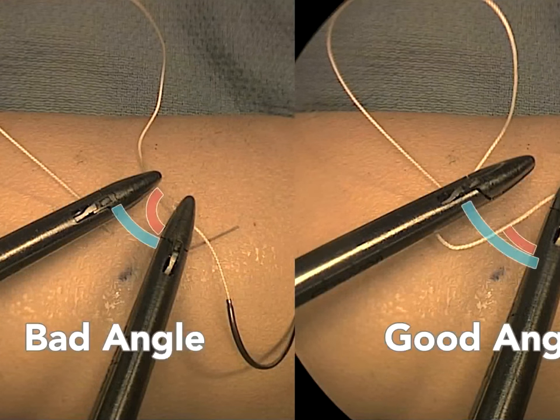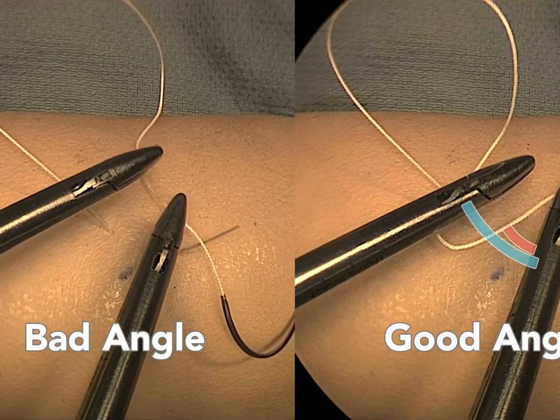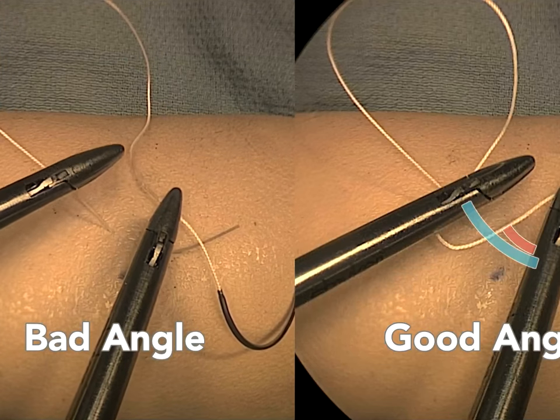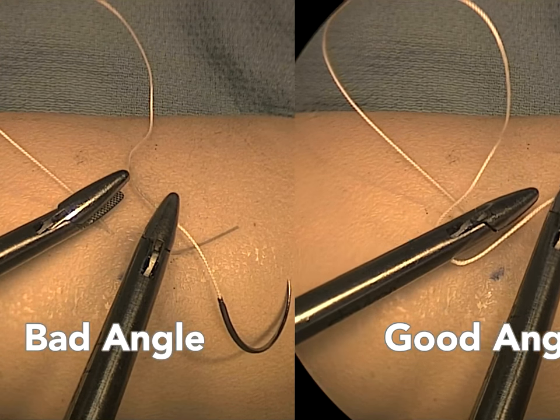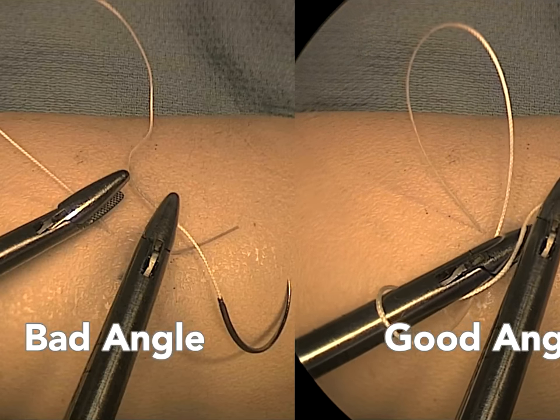In this next sequence, where ipsilateral port placement results in an even smaller instrument angle, even smaller suture angles are necessary. Without a smaller suture angle, attempts on the left to wind the instrument around the suture are futile. On the right, with the instrument angle equal to the suture angle, winding twice is nearly effortless.